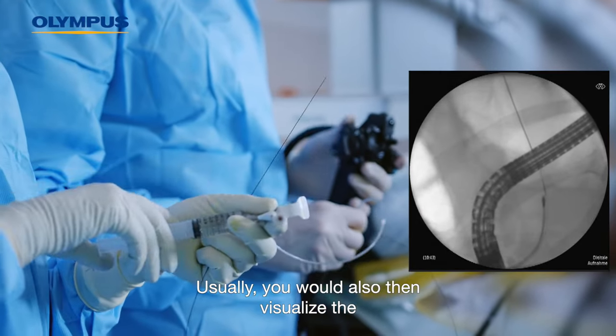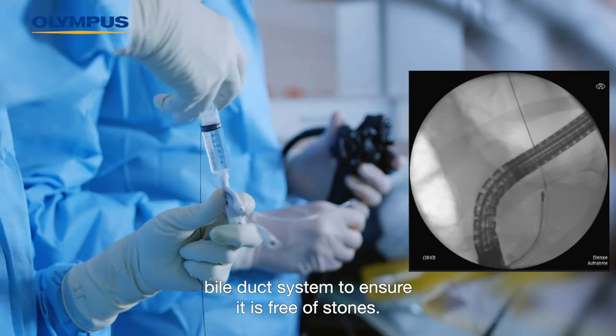Usually, you would also then visualize the bile duct system to ensure it is free of stones.